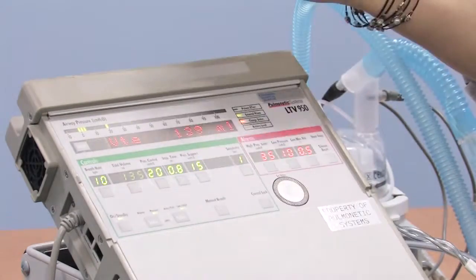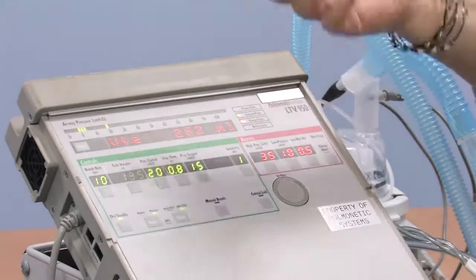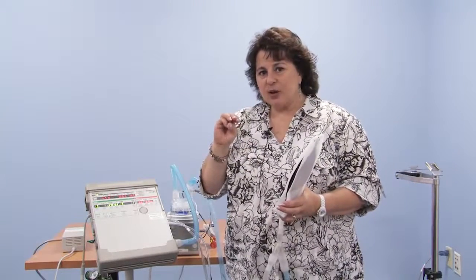So if we say 140 cc's, think about an ounce is 30 cc's. So this is like, what's like 4 ounces, that breath. Think about a 1 liter pop bottle, and think about, half of that is 500, a quarter of that is 250. So if you think about 30 cc's an ounce, it equates to air, if you want to just in your mind to think about how big the breath is.